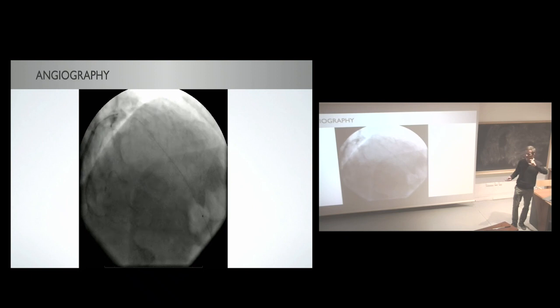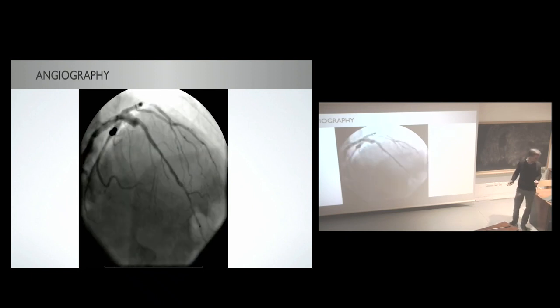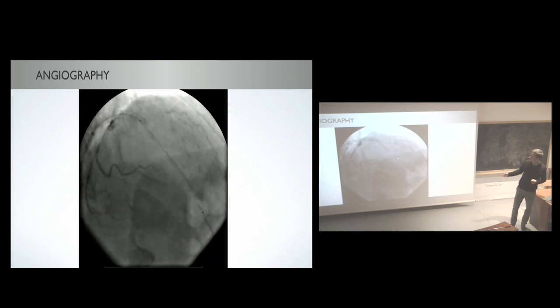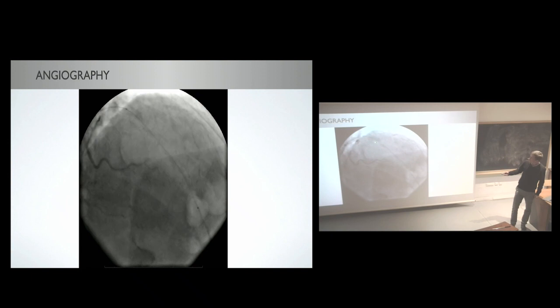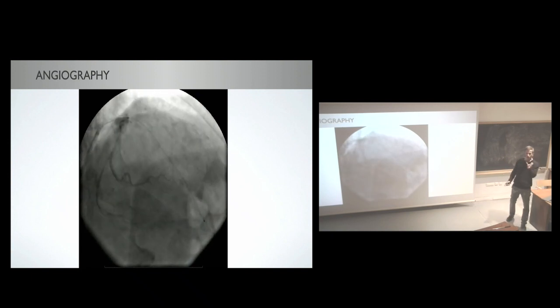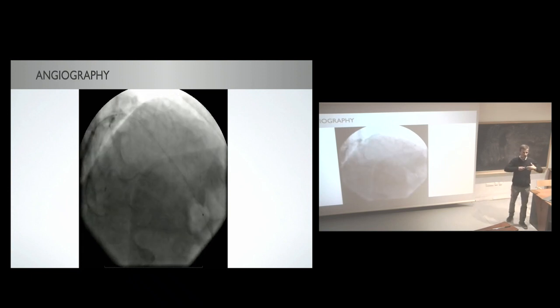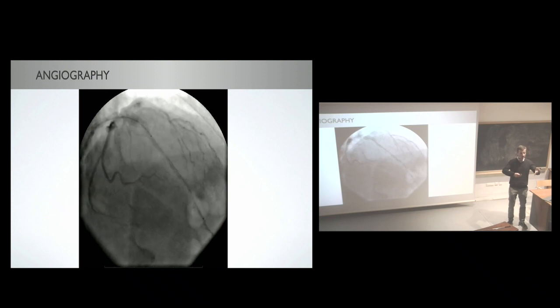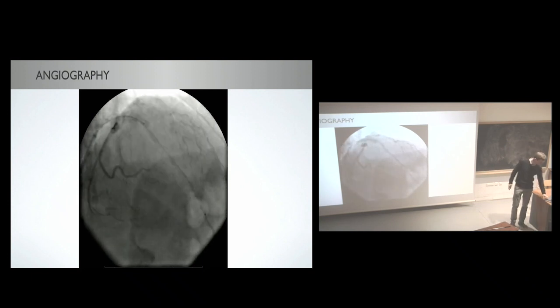That's X-ray through the patient. You inject a radiopaque contrast agent into the blood vessel to get contrast in X-ray. And if you look very carefully here, you see the small dot pulling back. That's the radiopaque tip on the OCT catheter that is performing a pullback. Again, while that contrast agent is in the vessel, the blood is displaced, and you get a view on the artery wall.